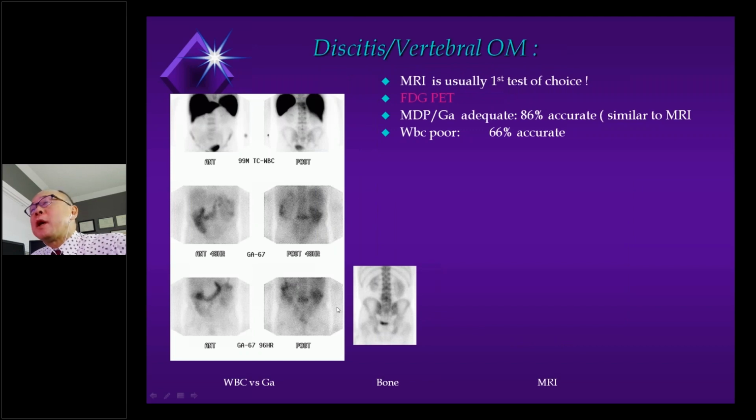Just to show you, and I promise I'm not trying to steal the thunder of my successors, just to show you what we will not advocate white cells for. An old case, a patient with discitis vertebral osteomyelitis. As concordant with literature descriptions, white cell appearance is typically that of photopenia. And this is an old case, obviously.